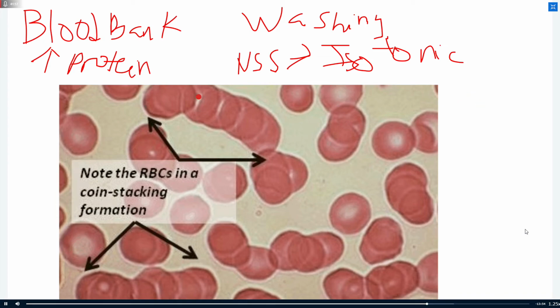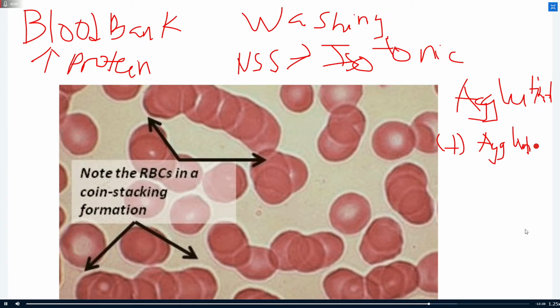Kasi class, if you look at this, mukha itong agglutination. And kapag nag-blood type kayo, a positive result is agglutination. So you need to avoid having a false positive. Malay mo, nag-rouleaux formation siya sa blood type B. Pero yun pala, negative pala talaga siya, blood type A siya. So ito yung pinaka-indicative of disease siya, Mr. Christian. Kasi increase ang protein mo sa blood eh.